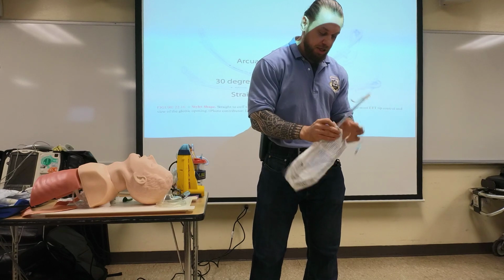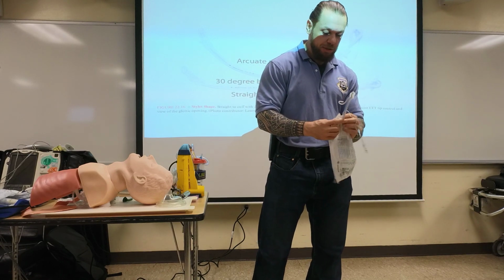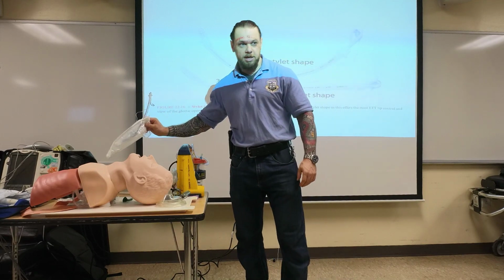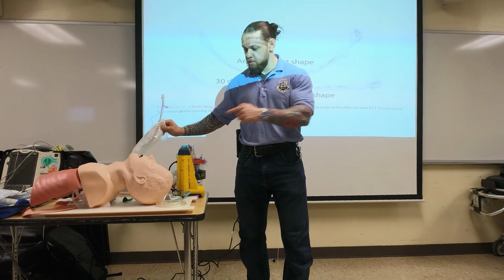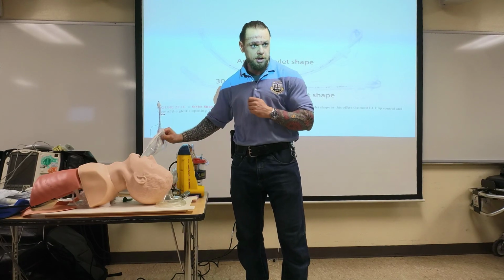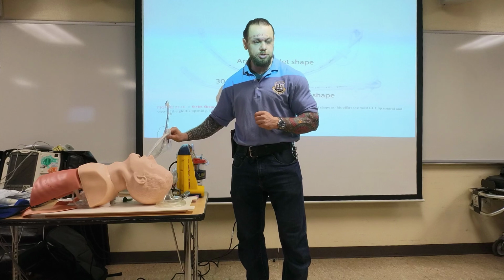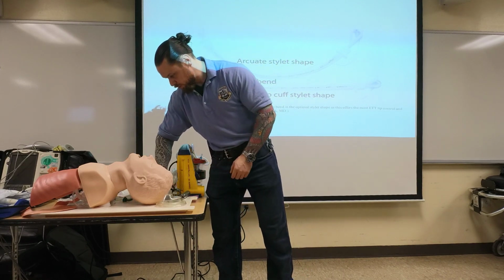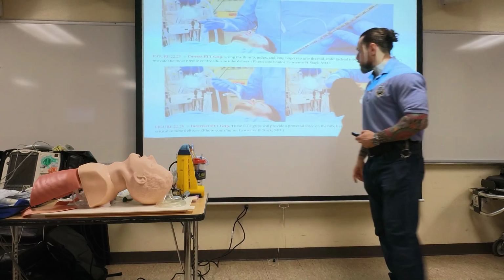And what I do is this. I would have whoever is my partner or any BLS provider hold it, and I'll say, stay by my side. The moment I see my structures, I do not want to take away my sight. I grab the endotracheal tube from the package. Everybody follow? So we'll do that. Talked about that.